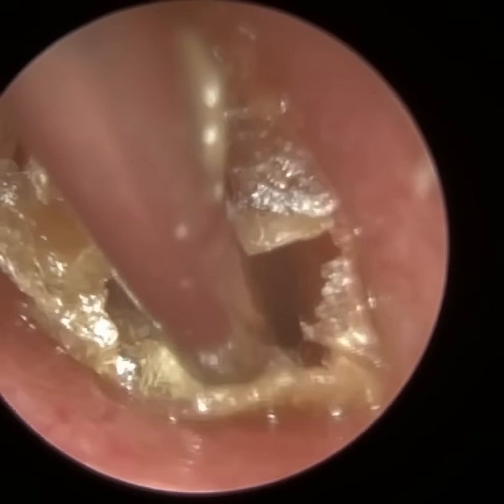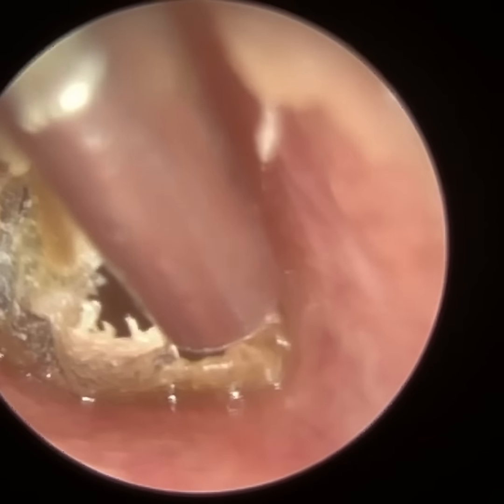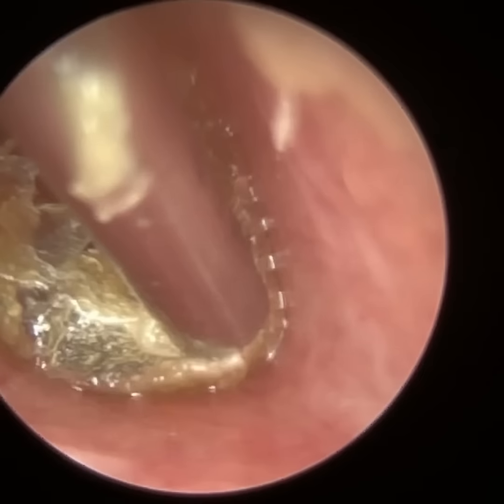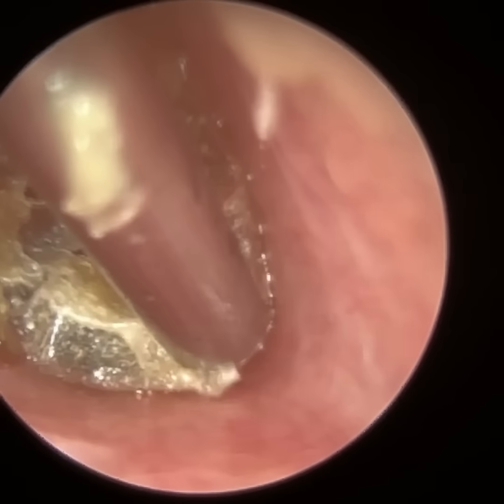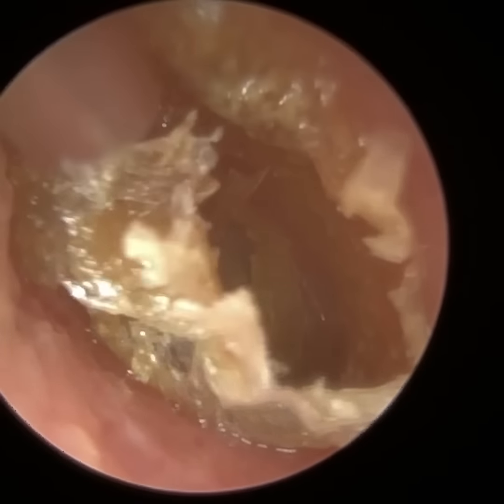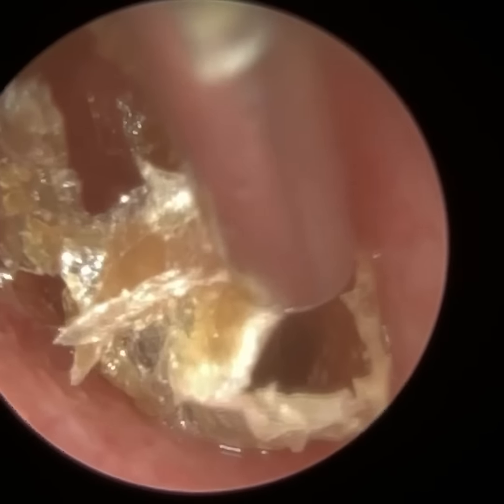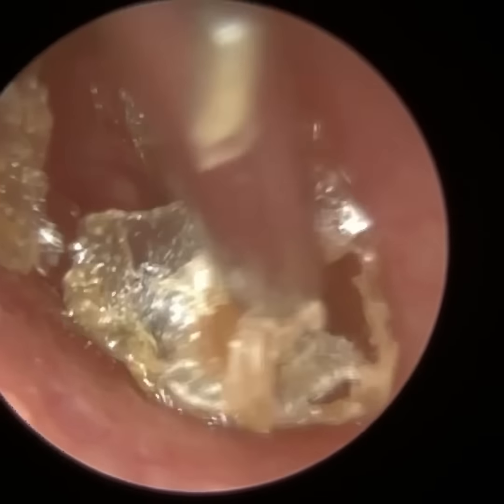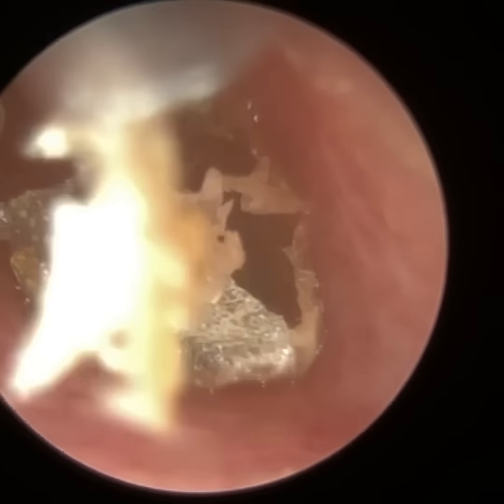I initially used the WaxScope, but I could sense this was going to be quite a tricky procedure — I have to go really, really closely to the canal wall, so I reverted to the endoscope. I still prefer the endoscope for really precision procedures like this. I used some olive oil spray just to loosen this skin using the fine end suction spray.